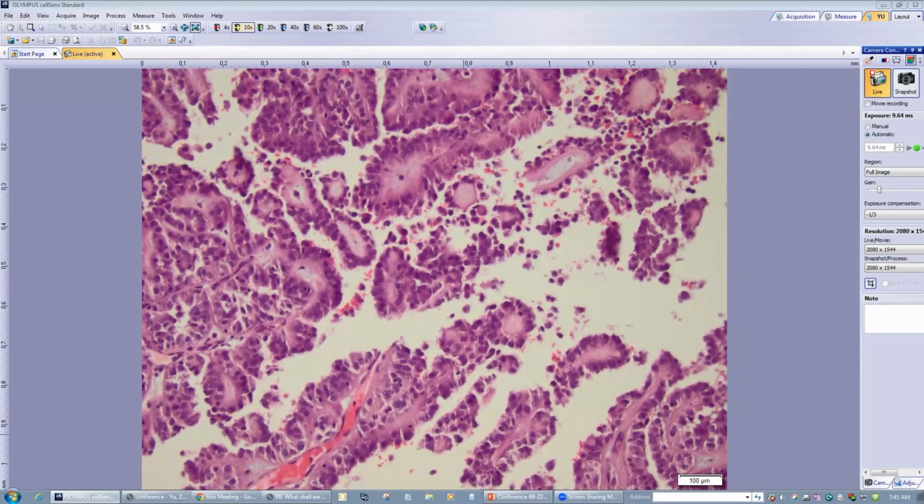Pediatric renal cell carcinoma could be papillary renal cell carcinoma, although this is pseudopapillary. Renal cell carcinoma has a true papillary pattern, not one generated by separation, so it is less likely. We also did CK7, and it was negative, making papillary carcinoma less likely.